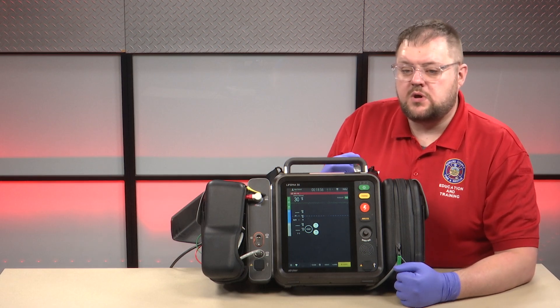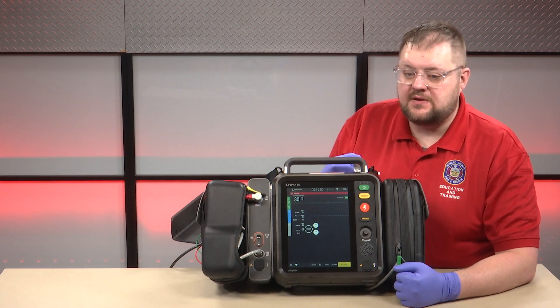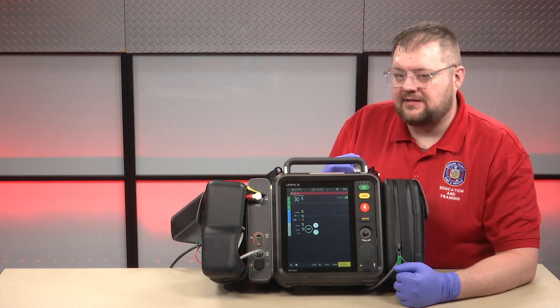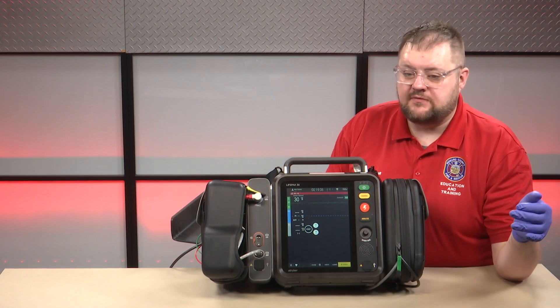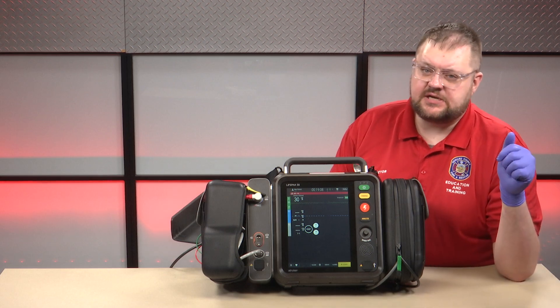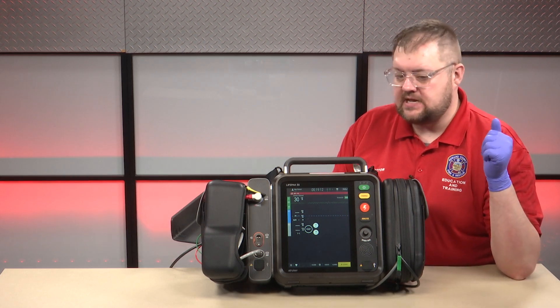In this video, we will demonstrate the manual defibrillation method on the LifePak 35 for ALS clinicians. Let's say that you arrive on scene with ALS clinicians present from the start, so we don't need to utilize the AED mode.